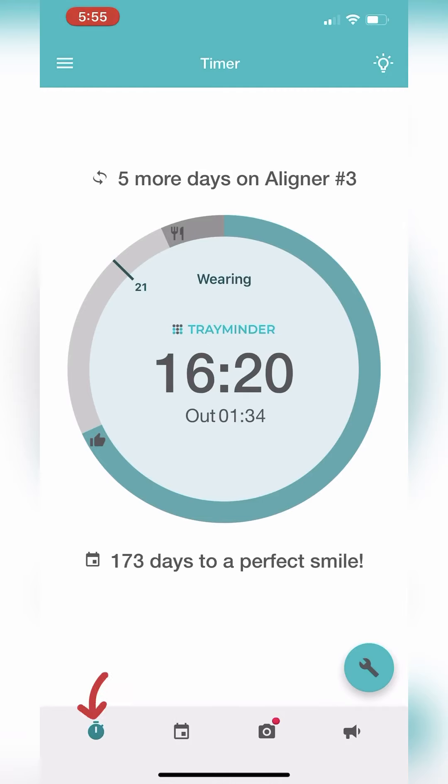The main page is the timer page. The timer helps you to keep track of your wear time each day. The big number is the in-time — it tells you the amount of time you have worn your trays since the beginning of the day. Today I've worn my trays for 16 hours and 20 minutes. The small number below is your out time, which tells you the amount of time you've had your trays out, such as for eating or brushing. Today my trays were out for an hour and 34 minutes.